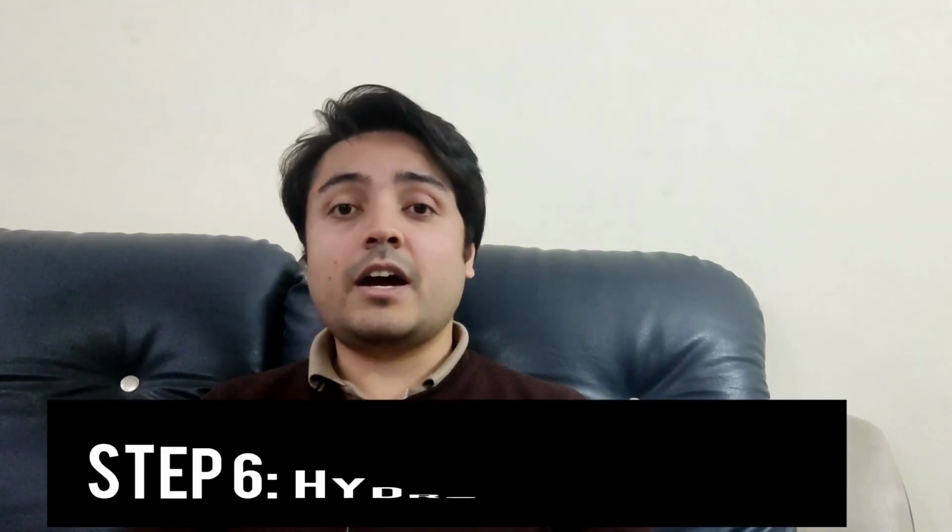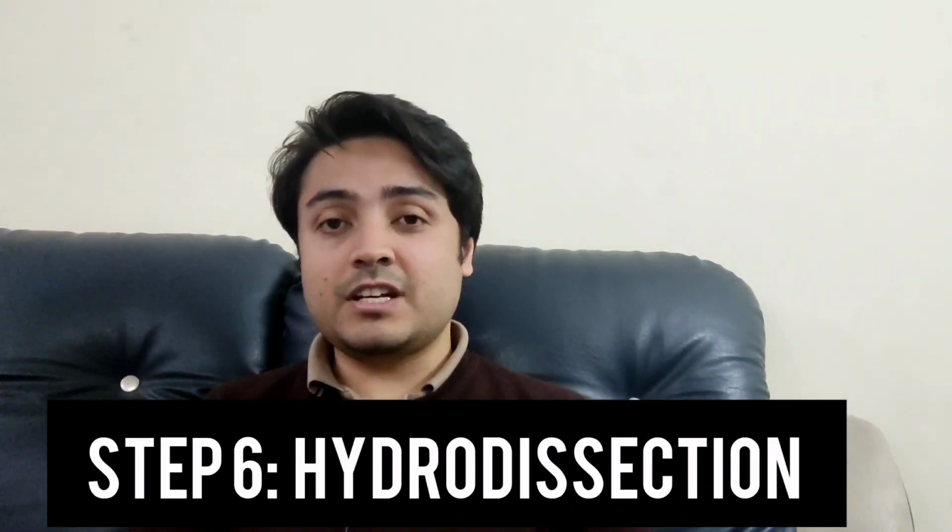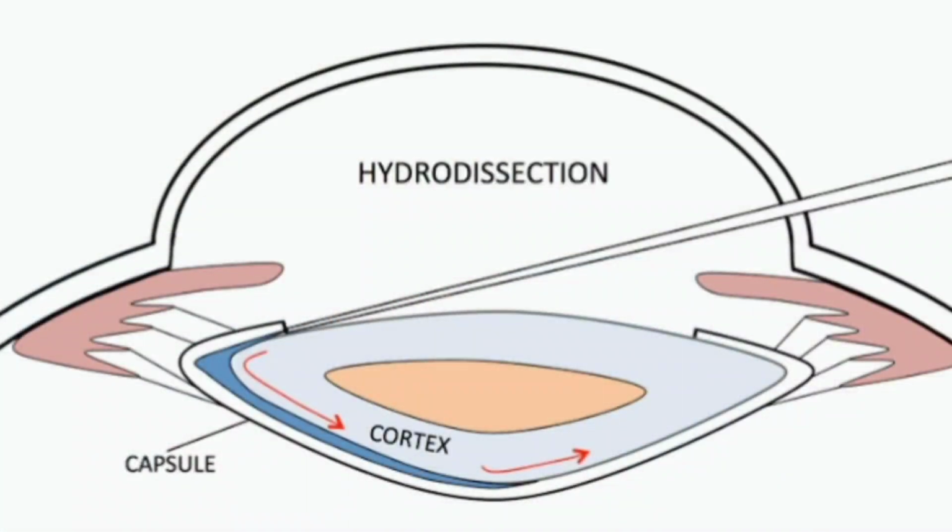The next step is hydrodissection. In this procedure, as the name suggests, hydro, which means water, is being introduced. Now this water is used to create a space between the lens cortex and the lens capsule, to loosen it up so it can be extracted easily.